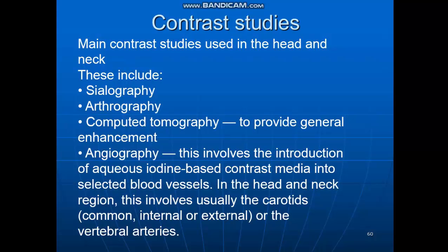Main contrast studies used in the head and neck include sialography, contrast investigation of salivary glands; arthrography, contrasting of joints, the temporomandibular joint in the maxillofacial area; computer tomography, where sometimes we use a contrast agent, especially for diagnosis of tumors to provide general enhancement; and angiography.